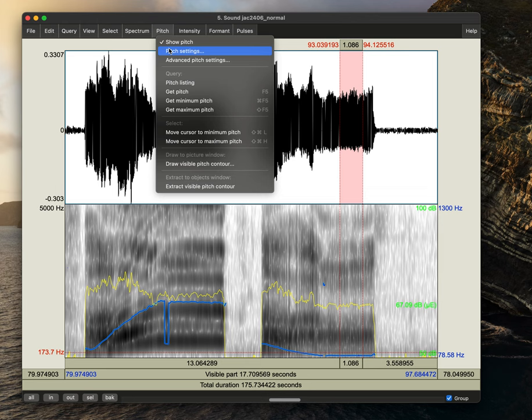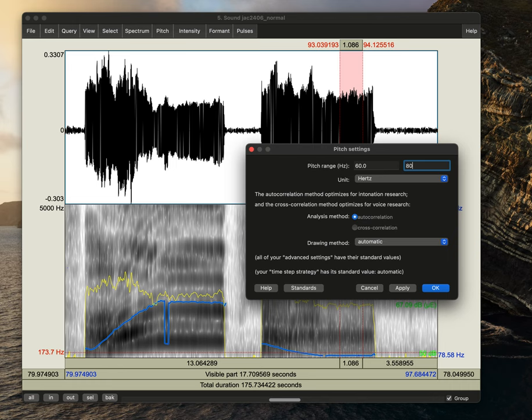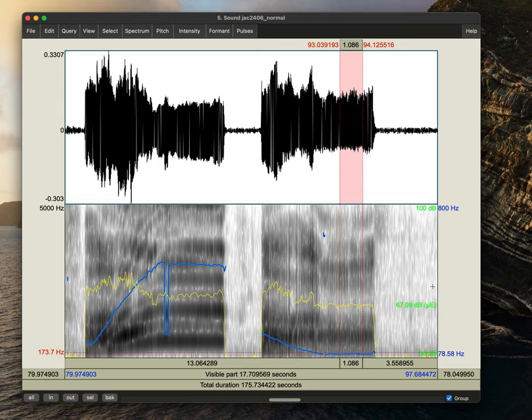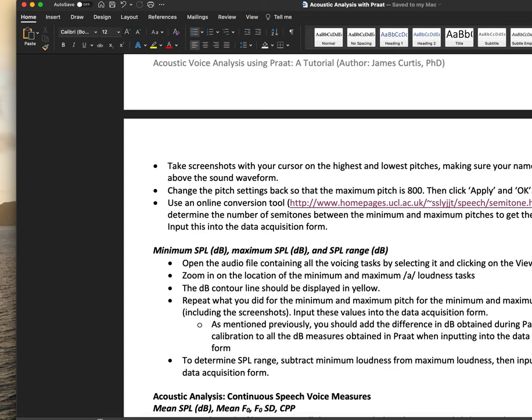I'm going to go back since we're done with our pitch ranges and we'll change this back to 800, apply and OK. To look at the pitch range, we'll want to convert this into semitones and so you'll find an online Hertz to semitone converter. Enter our minimum and maximum ranges and that'll give us a range in semitones.